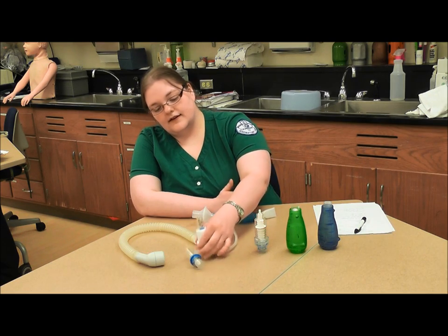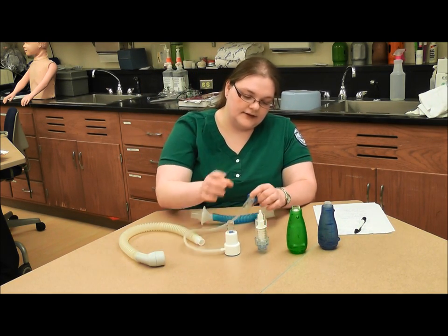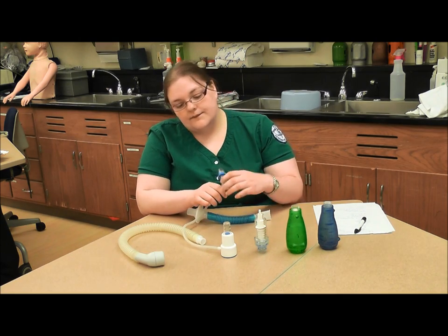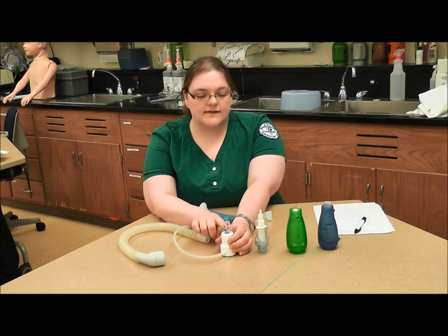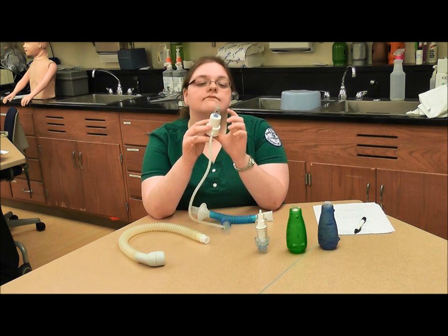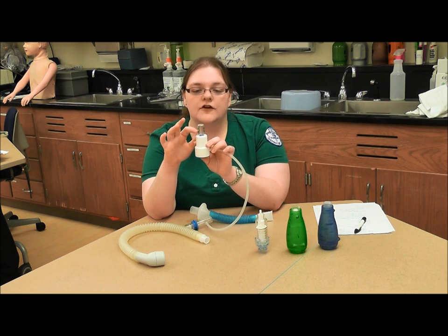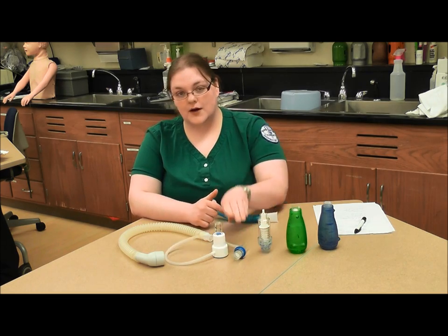Here we have another PEP device. This is an orifice PEP device, and the patient blows into one end, and we adjust the resistance as necessary for the patient. The goal for this one is to obtain a consistent output to keep this little blue valve or plunger floating between the black arrows. That way, it's kind of similar to an incentive spirometer.